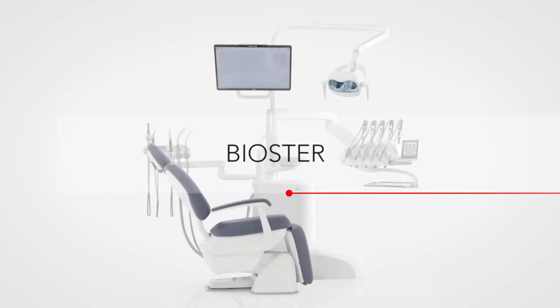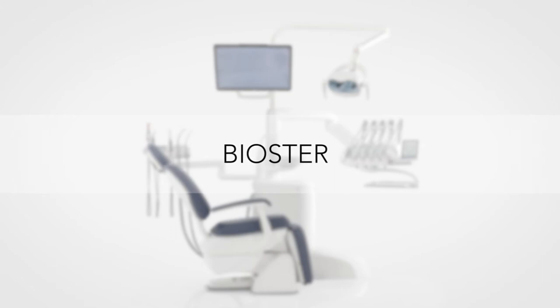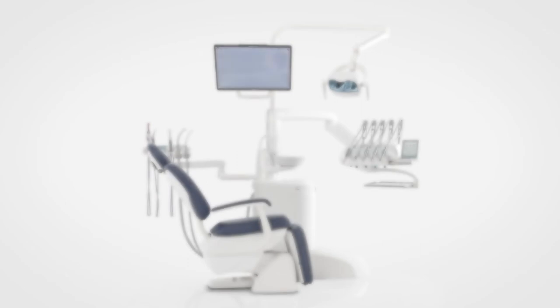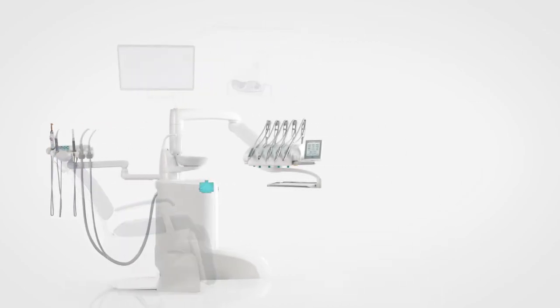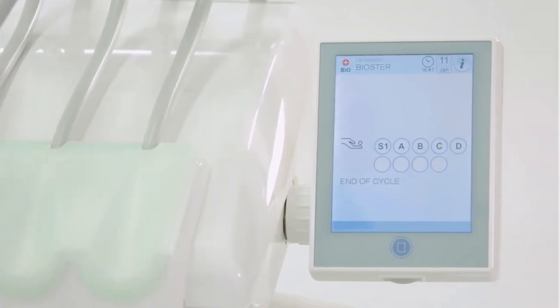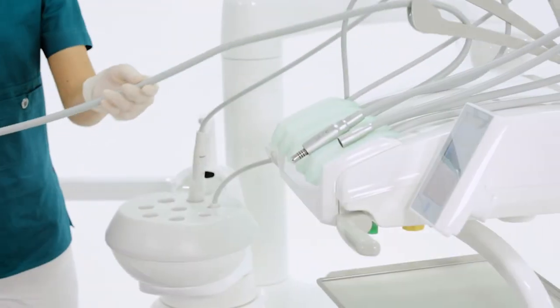The fully automatic Bioster system allows for fast running of dental unit water circuit disinfection cycles with 3% hydrogen peroxide based disinfectant. The following steps are performed: emptying the instrument's water circuits; introducing liquid disinfectant and starting the disinfectant contact time until the required value is reached; emptying the disinfectant and rinsing of the circuits. At cycle end, the full touch control panel displays the message 'end of cycle, put back instruments.'